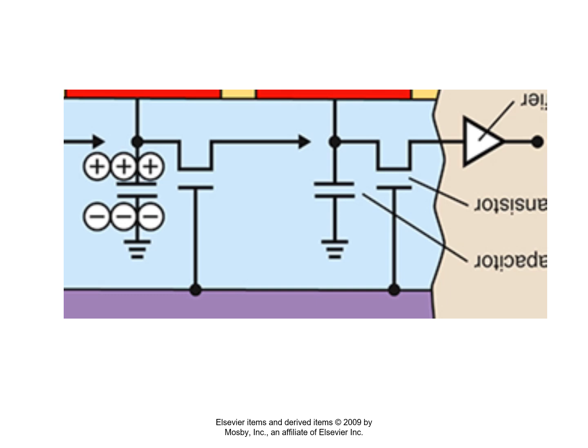So if I have 3 positive charges stored and I want them to move through the gate, I'm going to supply the gate electrode, which is that flat thing, right? There's like a U-shaped wire and then a little flat thing. That's the gate electrode. I'm going to supply that with 5 negative charges or 10 negative charges.